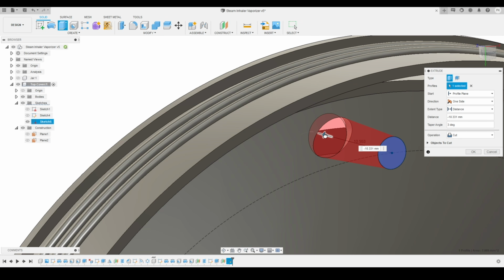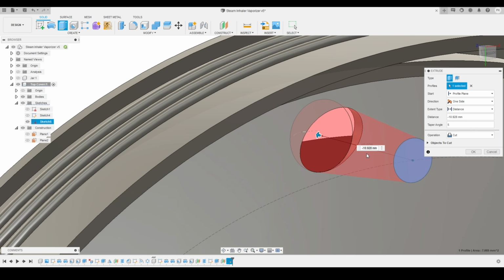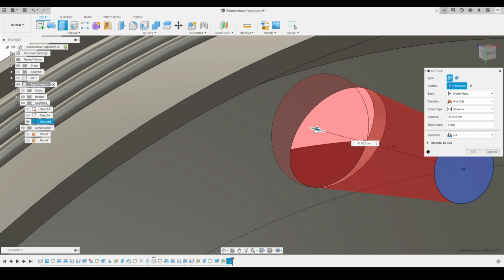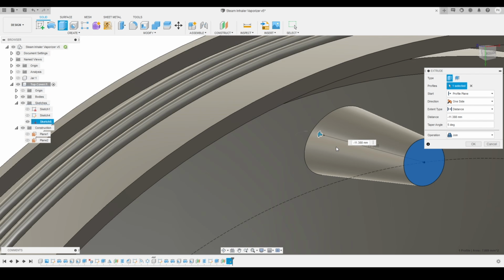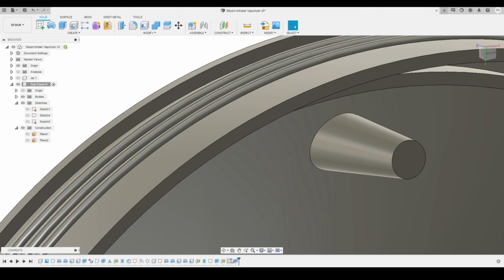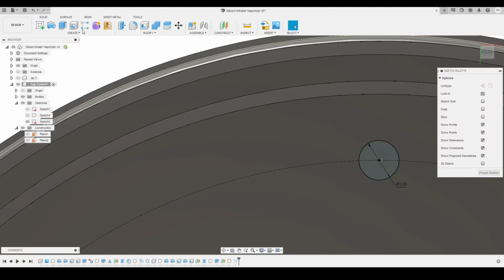So I'm adjusting the location a little bit more. Here you can see, and now I will change the angle to 5 degrees. I think 5 is better, and we'll move on to our operation and make sure the operation is joined. It's looking good, and we'll press OK. So here you can see this is the result we got.